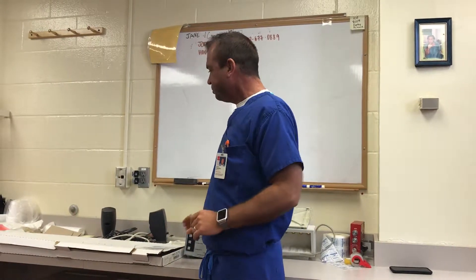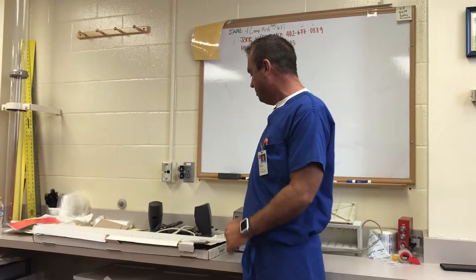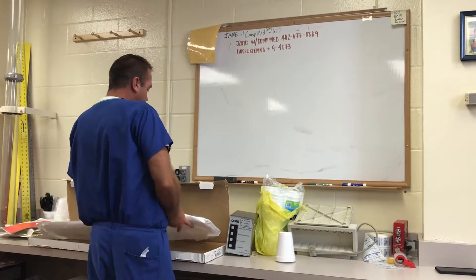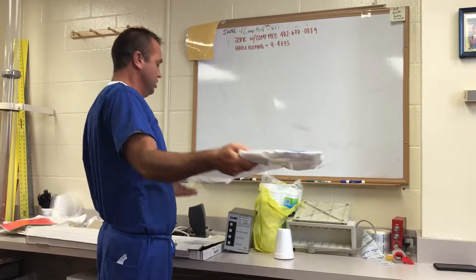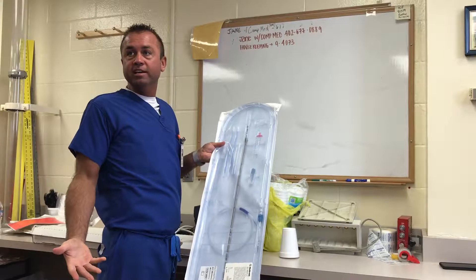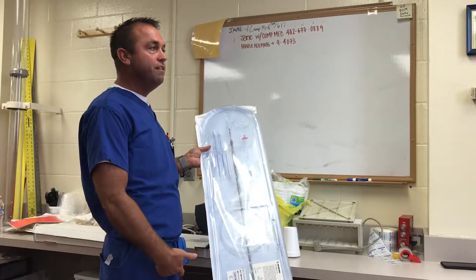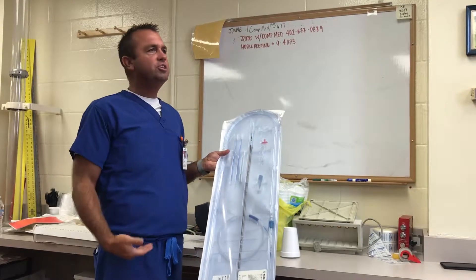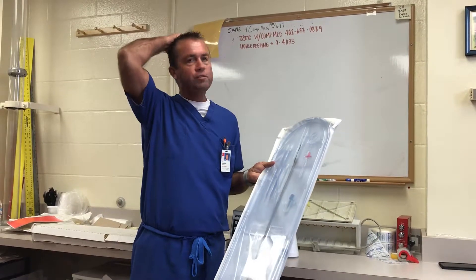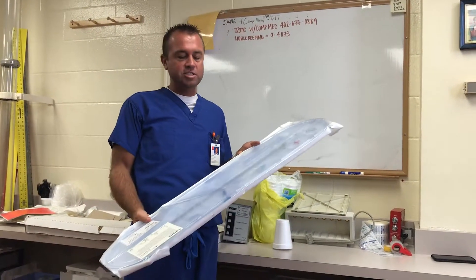So this is our vessel. We're going to take a Medtronic Biomedicus cannula — a 21 French Biomedicus cannula. This is a really long cannula. It's venous, because we need to go from the femoral vein all the way up into the heart. The arterial cannula is a little bit shorter. Cannulas come in different French sizes depending on vessel size and patient size.